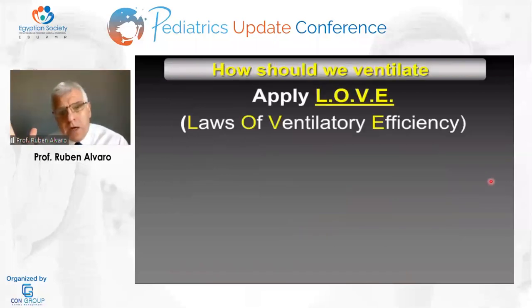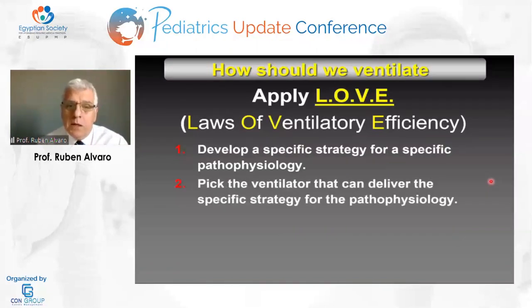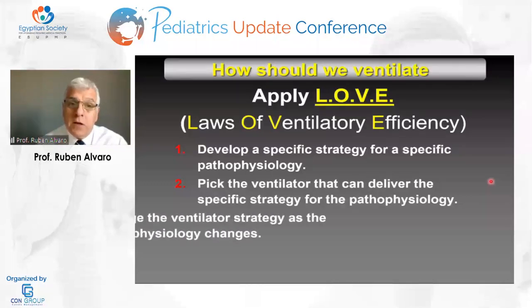Well, about 34 years ago, we only had one ventilator, and that was used for any kind of lung pathology and all types of babies. Nowadays, thanks to the technology, we have many different types of ventilators, and we know now that not all lung pathologies can be ventilated equally. We need to pick the ventilator that is best for that lung pathology.